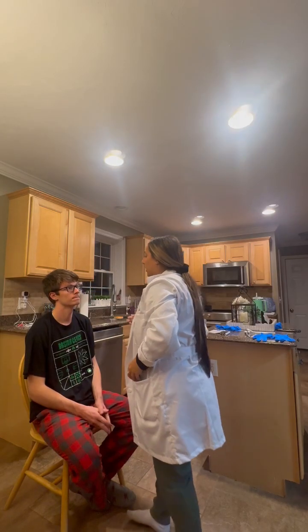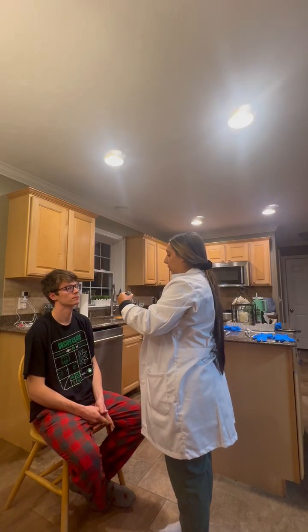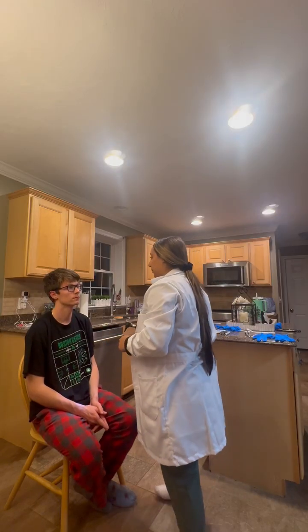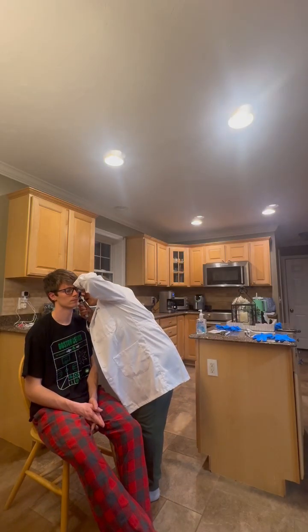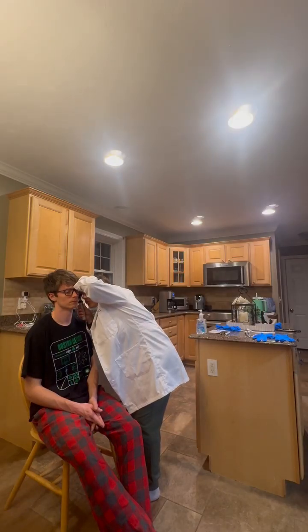Sometimes people with painful palpation to the pinna, it might let you know that they have an ear infection. So I'm glad you don't have any pain. I will now examine your ears. Okay. All right. I am looking for canal patency, cerumen.